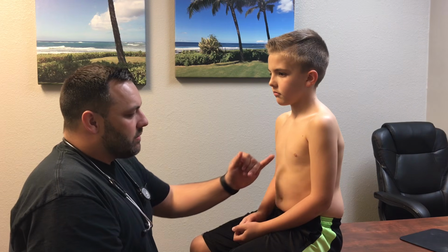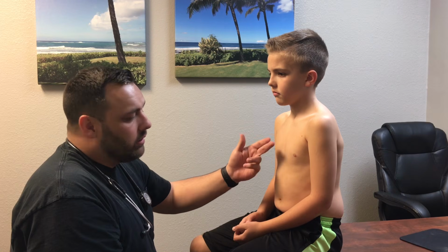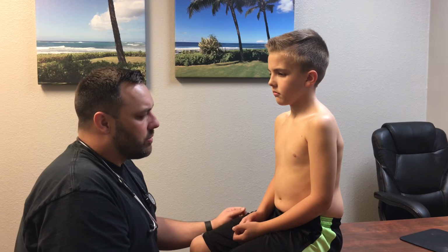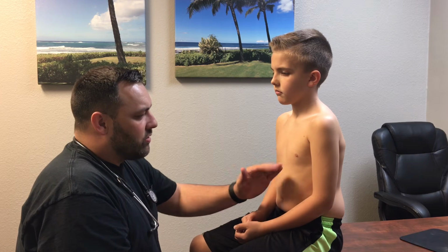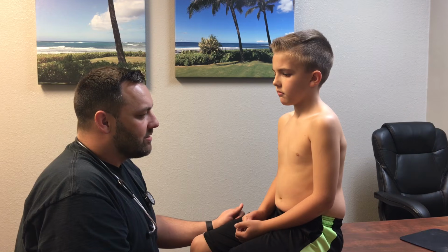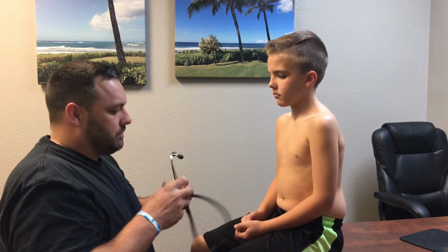Now, something that's added in this assessment is the Erb's point, which is anywhere from the 2nd, 3rd, 4th intercostal spaces. So we'll inch down our stethoscope as we do that as well. His heart is probably a little bit smaller, the apex of it, so I might have to listen just a wee bit higher to get the sounds that I need, but the principle is the same. So, okay, here we go.